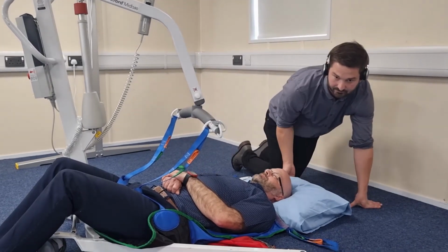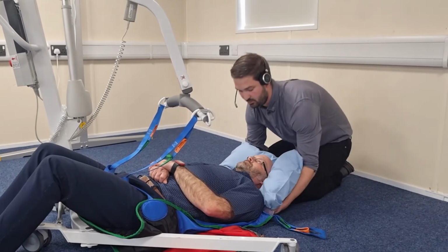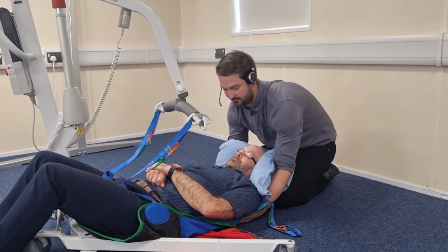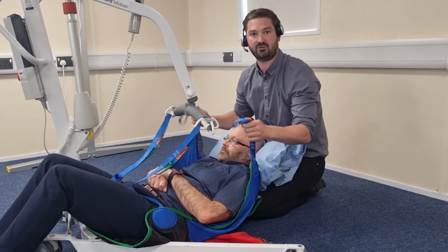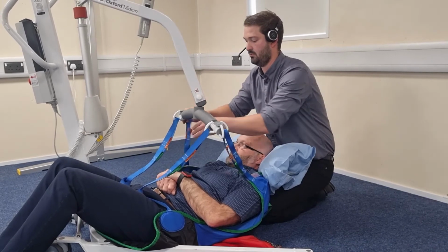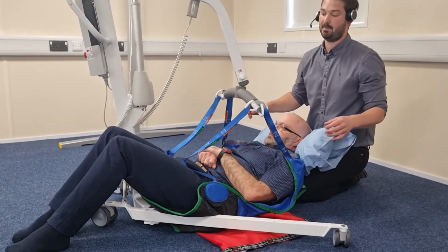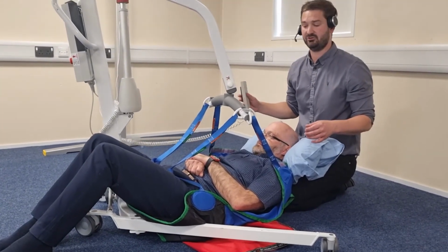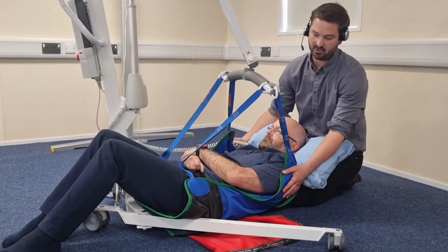So I'm going to come in behind. And what I'm going to do is I'm going to put two flat hands underneath the person's shoulders, there. And then I'm just going to gradually start to walk in a little bit closer. There we go. And that's just made it so that I can attach these shoulder loops onto the carry bar. Once they're on, I'm just going to do another check, make sure that all the straps are attached securely. I then position my handset in a location where I could easily reach from this position. And I'm going to begin to raise the person up.